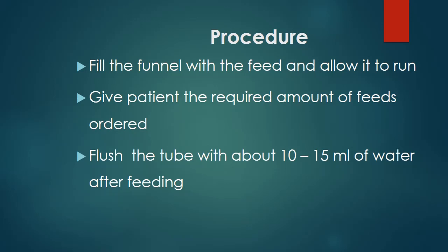So because of that, there's always a risk of the patient experiencing abdominal cramps because of the air and possibly the pressure with which the food was introduced. So that is a main disadvantage of the push or the bolus method of feeding. But the gravitational method is the ideal.